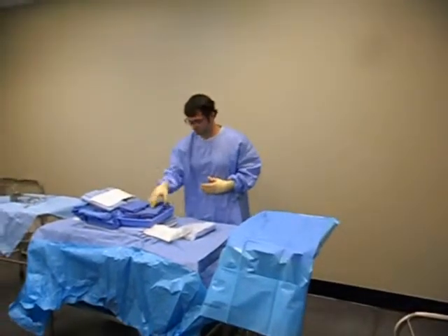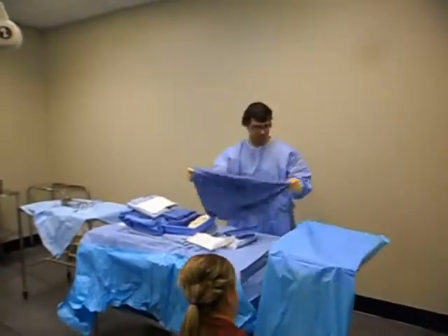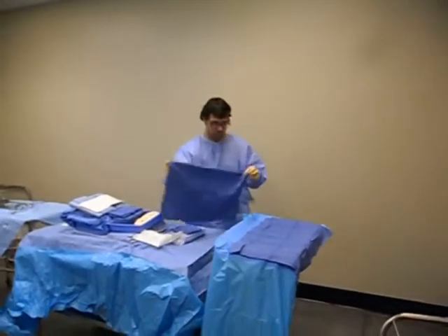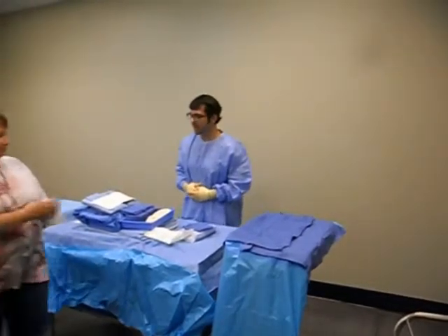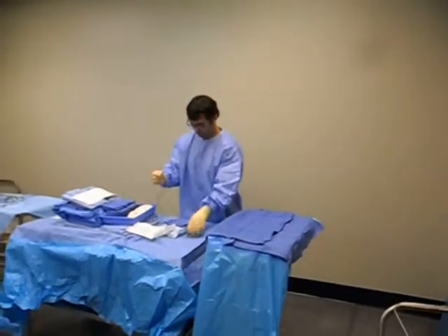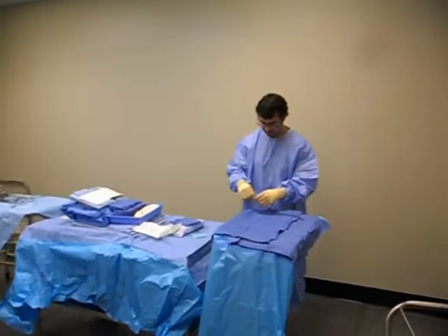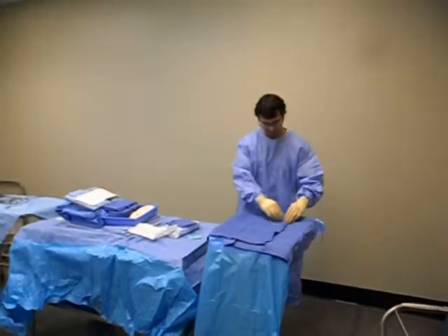Allison, pull it down for him from underneath, will you? If I had some free ties, which I'm definitely going to have, put those down right now. Take them out. Two to me, three to the tree. Open them up. There. And you're going to want to take that foil off.